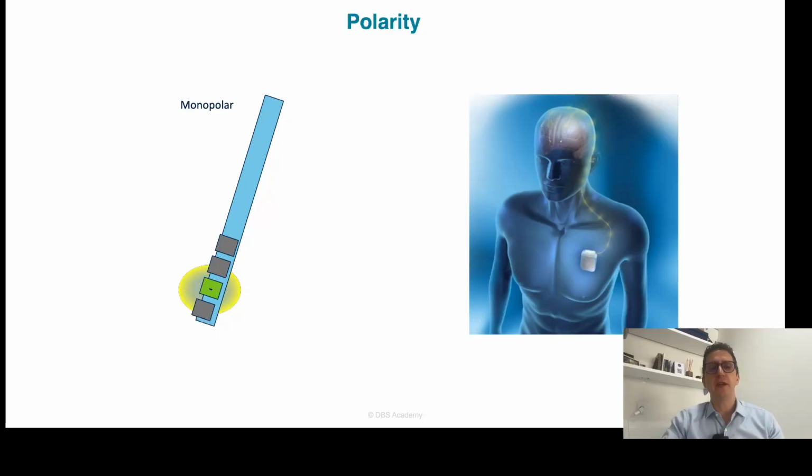So basically the idea here is when this negative ion flows into the brain near the cathode, as you remember, outside the neural membrane it's positive. So if I'm delivering negative ions over there, there is a kind of decrease in the voltage across the membrane. And when you decrease the voltage, you are going to elicit the depolarization. So that's the way the DBS works. So imagine that you are doing this 130 times every second.